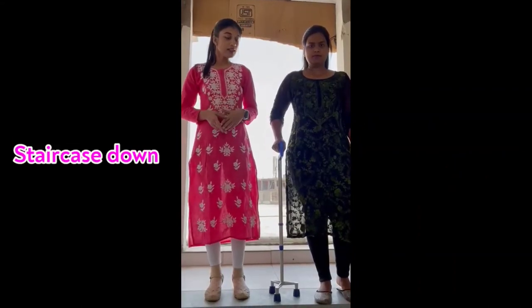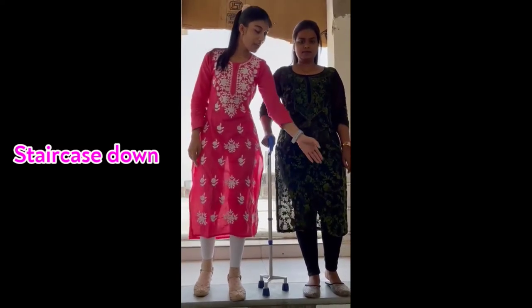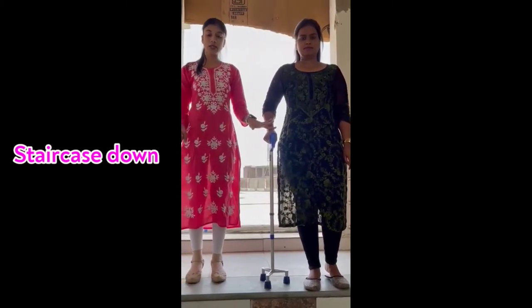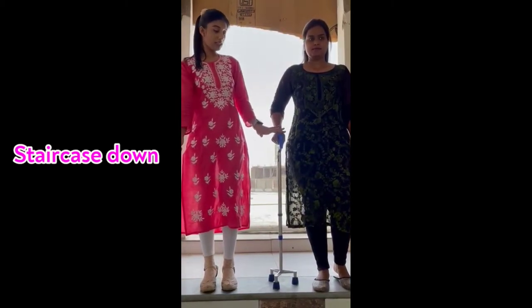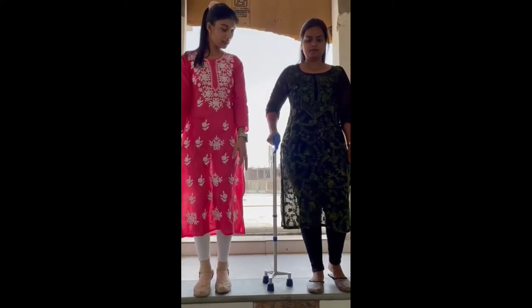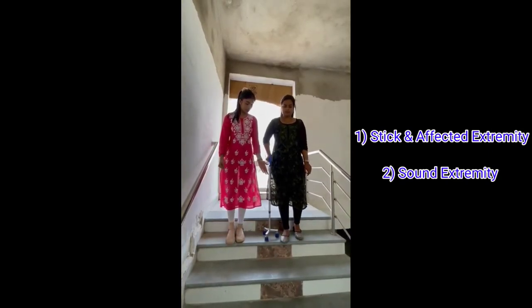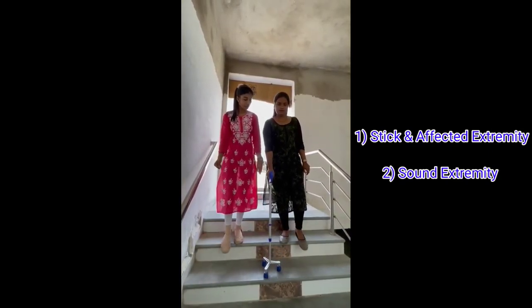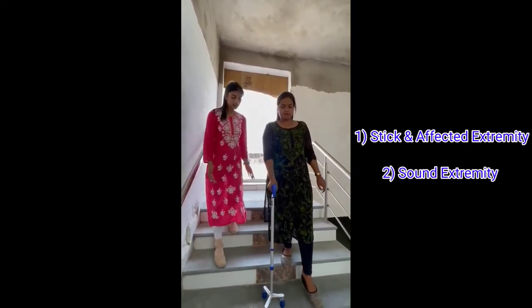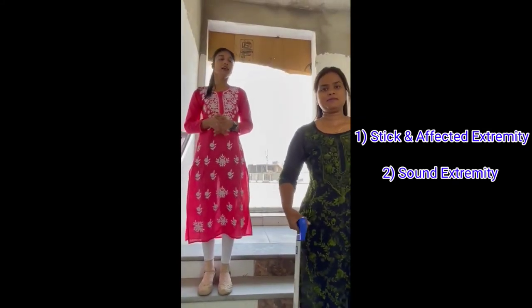As I told you earlier: bad goes down — that is, the affected limb goes down first. The left extremity is affected, so it comes first when going down. You have to keep the stick as well as the affected extremity down first. Keep the stick with the affected extremity, then follow with the non-affected extremity. Again: stick, affected side, then non-affected side. This is how we go for stair descent.